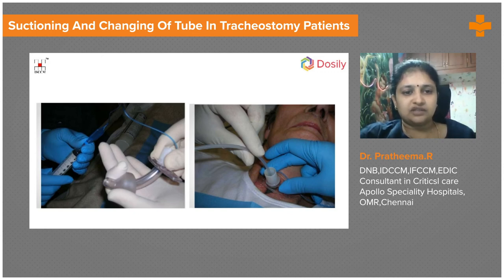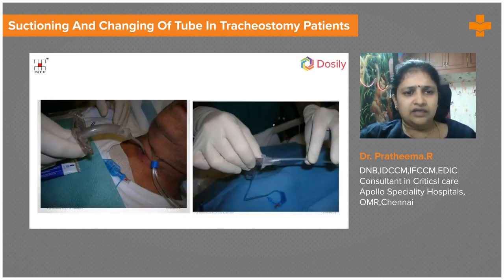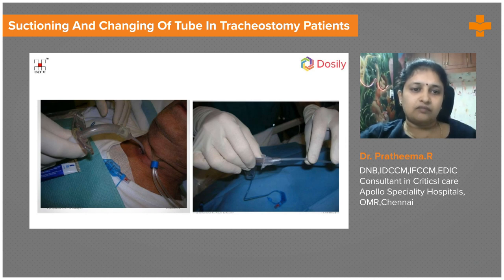Before the change, the new tube is checked for patency, the cuff is tested, and it is deflated and kept ready. A suction catheter with gel applied is placed through the old tracheostomy tube as a guide wire — gel is used to reduce coughing, as violent coughing can dislodge the tube and cause a false track. The old tube is removed, and the new tube is railroaded over the suction catheter guide. The position is then reassessed and the tube is secured.